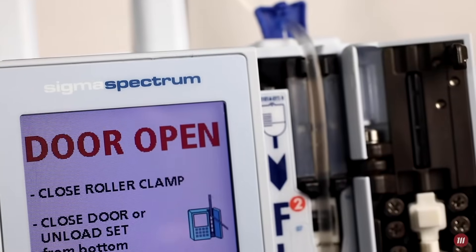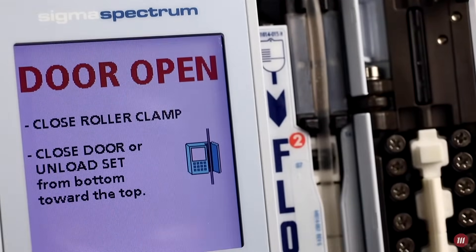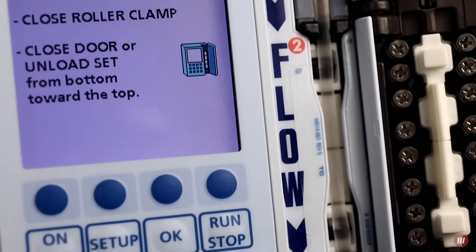The flow rate range capability of the Sigma Spectrum is 0.5 to 999 milliliters per hour.